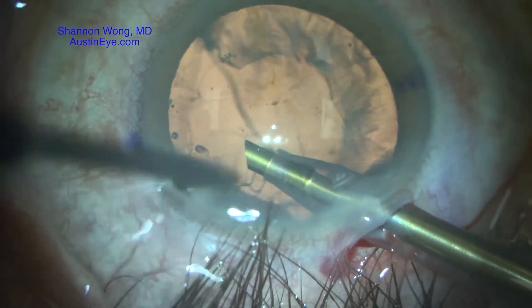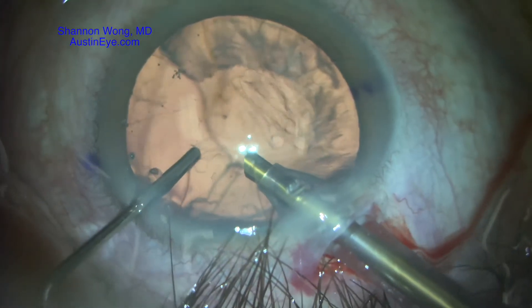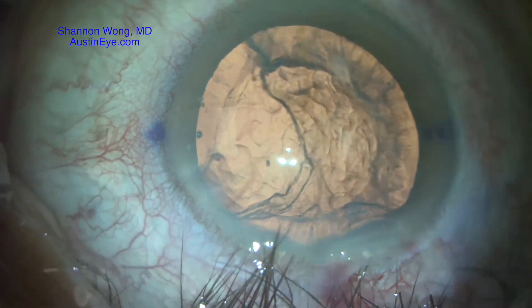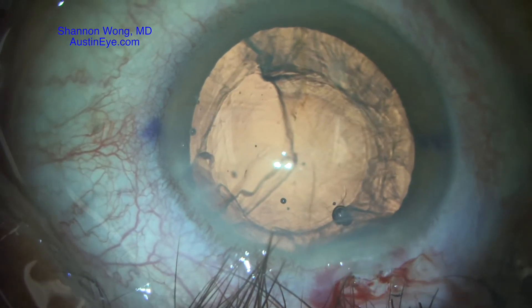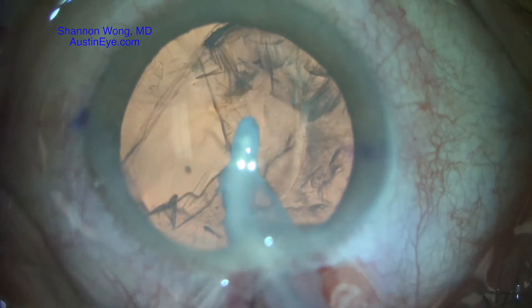We then use viscoelastic to stabilize the anterior chamber before we remove our phacoemulsification instrument. We then note that there's likely to be an opening in the posterior capsule as well as an anterior capsule extension.